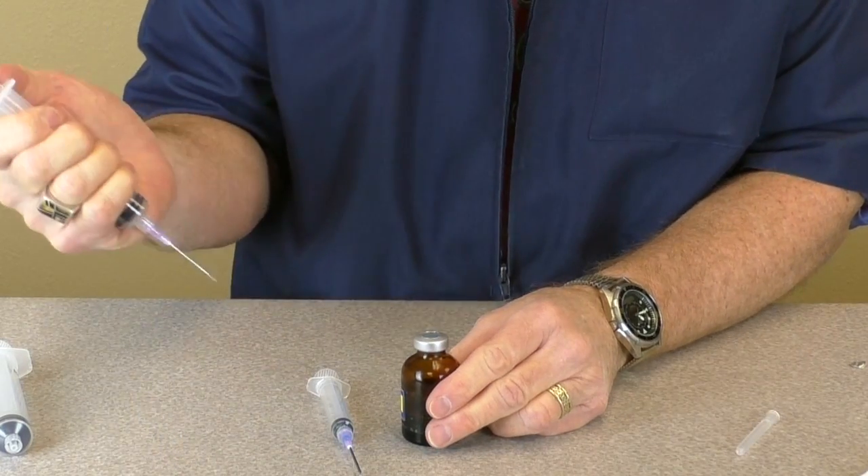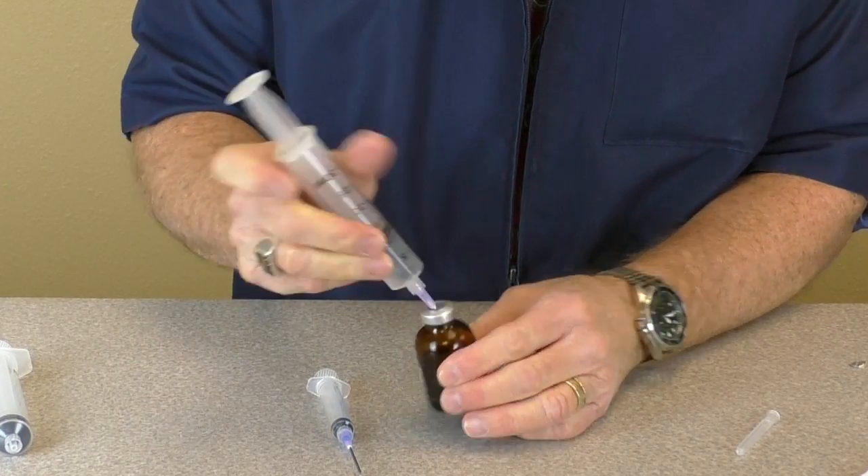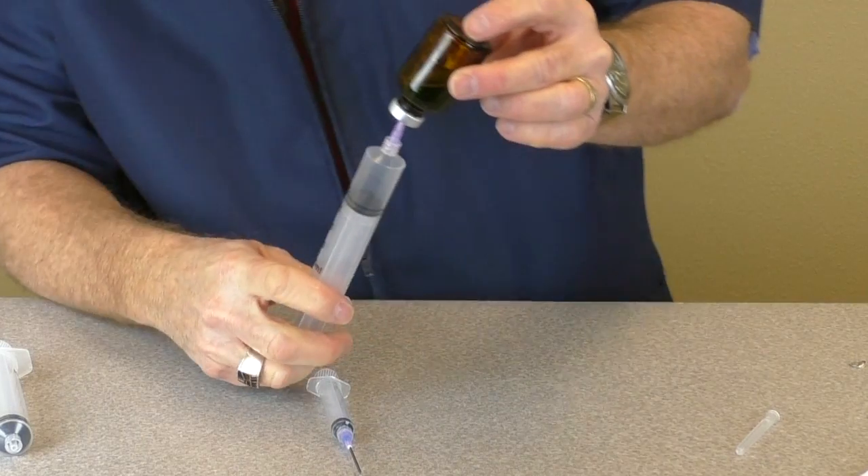Pull back the plunger of one of the larger syringes to the 10 ml mark and inject that air into the poloxamer vial above the liquid level to avoid bubbles.